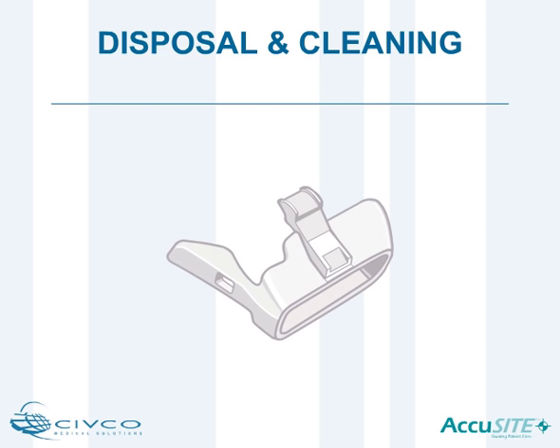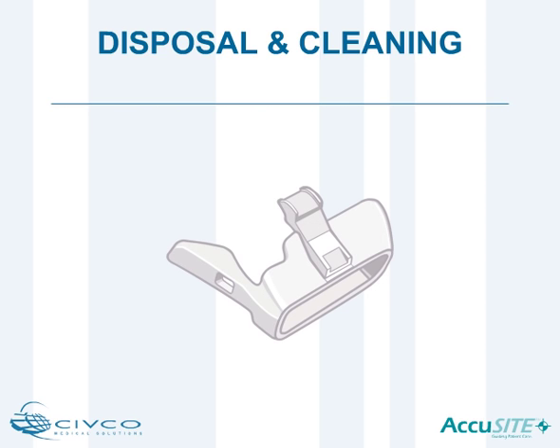Clean the reusable bracket — do not discard it. See your system's manual for reprocessing the reusable bracket between uses.